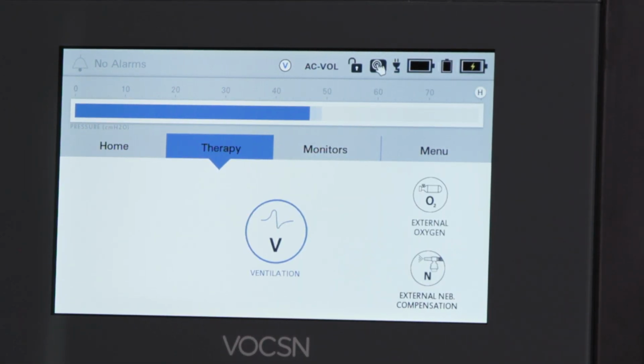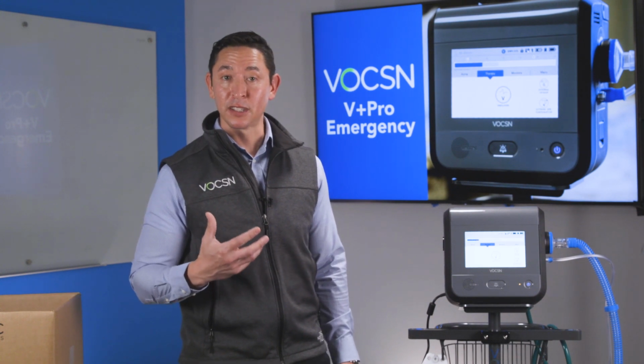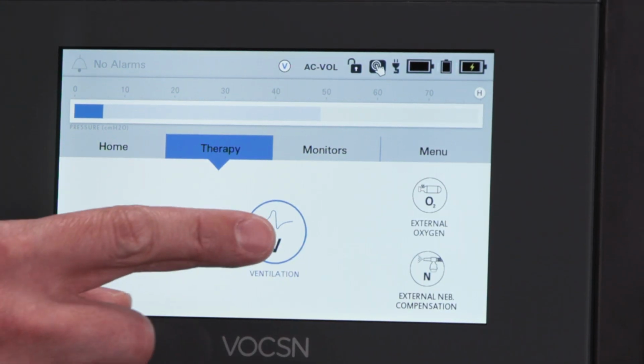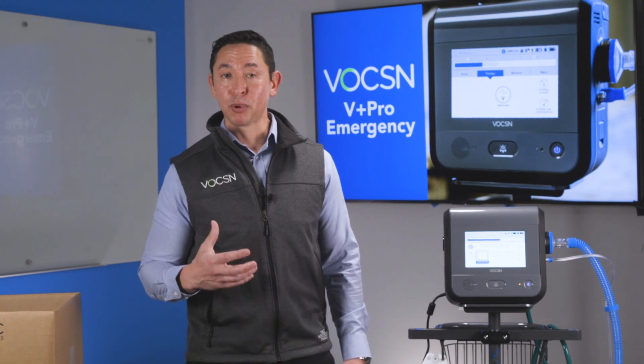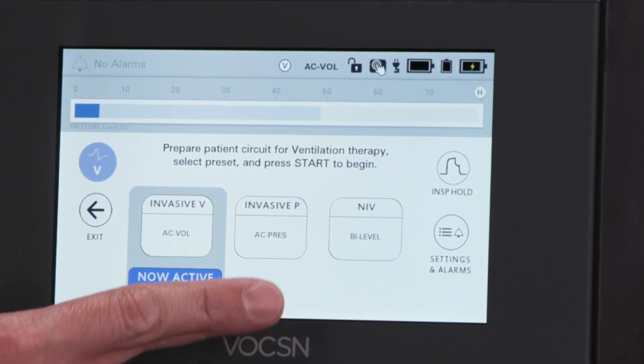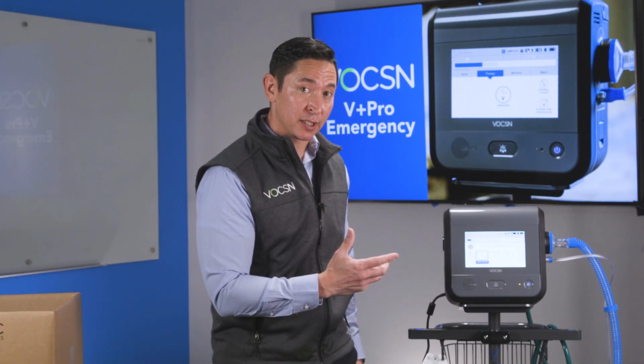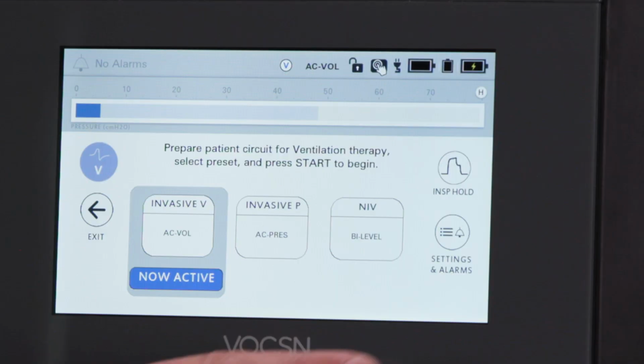And this is where we're going to get access to the therapies that are available. If I want to know more about ventilation, I simply touch the V for ventilation icon. Now your VOCSN V+Pro Emergency comes preset for AC volume, AC pressure, or non-invasive ventilation. If I want to make any changes, I simply touch the settings and alarm icon, which is just right there.